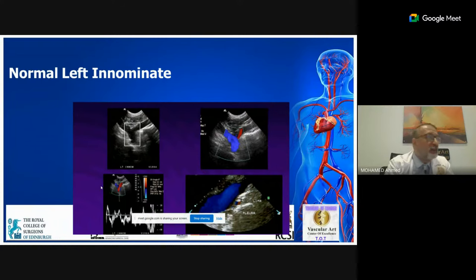You want to know if the shunt is patent or not. Is it going to have a good flow in the superficial vein? Or obviously, has it not matured? How can you measure the flow in the shunt? And this is important, we know the rule of 5. And is there any stealing phenomenon or not? And now there is a new indication.